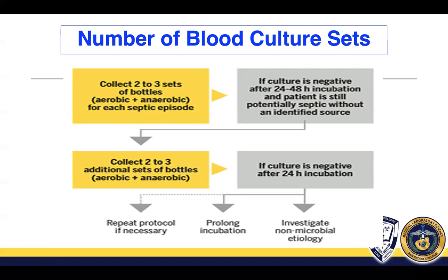If the culture comes back negative again after 24 hours of incubation, investigate non-microbial etiology. It could be viral. Remember, viral organisms do not respond very well on culture media that we use for bacteria. They don't just grow in any environment.